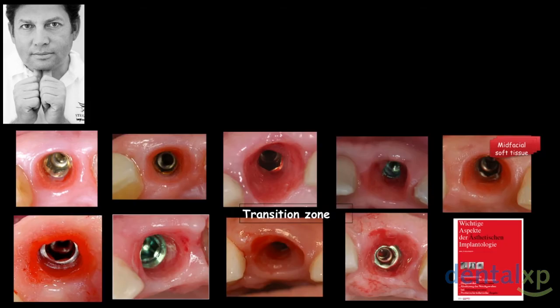And when we look at the cases from the study, here are 10 examples, the implants are placed in different positions. Some would say the first implant is too buccal. Yes, but we can correct it prosthetically. Too buccal is slightly more buccal than the incisal line. And we will look: is a connective tissue graft needed for implant placement? I disagree totally. Because if the implant is placed in the cingulum position, according to the new research, we see we have enough soft tissue. There are a lot of publications on immediate implants with connective tissue graft. Yes, but it depends on the implant position and angulation.